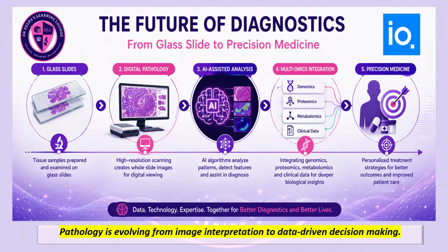Once it's ready for use, all of this is done like magic by the AI. Once the AI is ready, it does everything for you. It checks the cells, it identifies an abnormal cell, it detects a tumor, it will count the mitotic figures for you, it will quantify your IHC marker, the percentage, whether you want to give it as 1 plus, 2 plus, or you want to look at the tumor cellularity. It will give you a clue. Where is the tumor? Where is the cellularity? There will be hotspots that are generated. There will also be a morphological pattern that it can pick up, which can be slightly inapparent in the early cases. Those also can get picked up. The ultimate goal of AI is beyond the isolated algorithms.